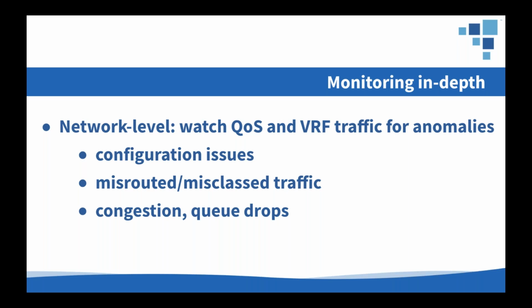It also lets us get alerts when something is behaving abnormally using anomaly detection, which we'll talk more about in a little bit.